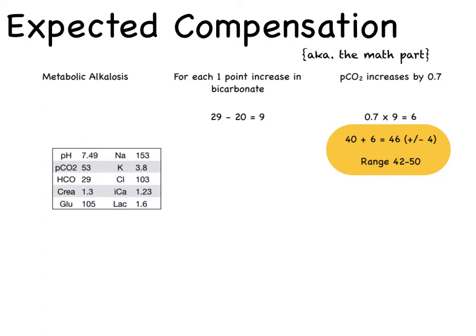Our patient's CO2 is 53. It's a little outside the range. So we probably have more than one process going on here. In this patient's case, maybe she's really dehydrated, or maybe she is in occult shock. Either of these could cause a mild metabolic acidosis to be present in addition to the more severe metabolic alkalosis, and those would shift the bicarbonate around some. The other possibility, when you see this, would be a primary respiratory disturbance on top of the metabolic disturbance. But she was reported to be bright and interactive and breathing normally, so this seems less likely.